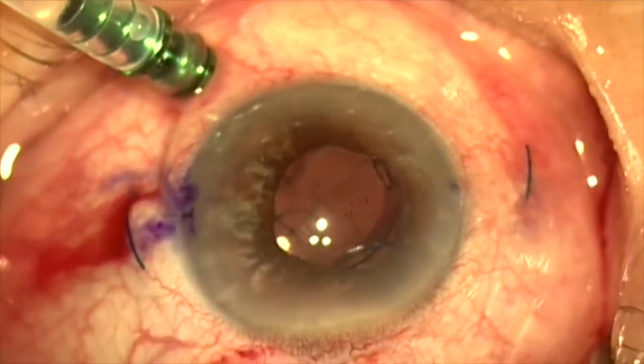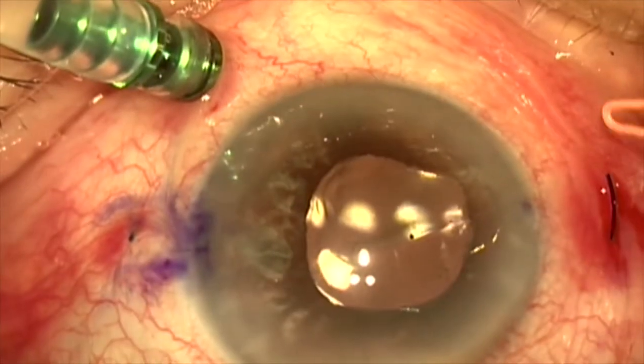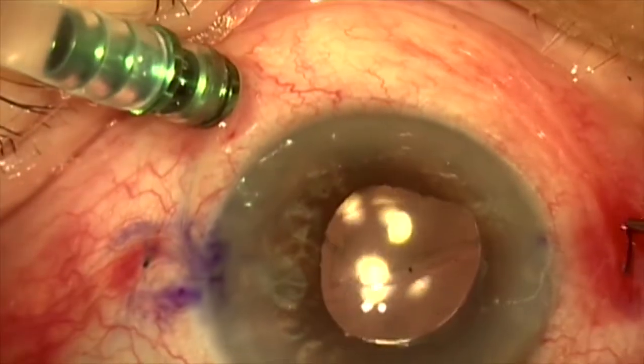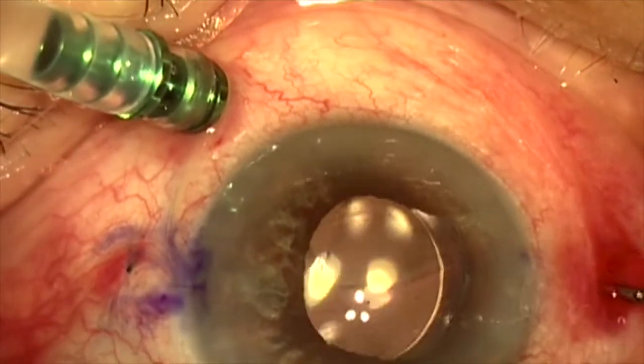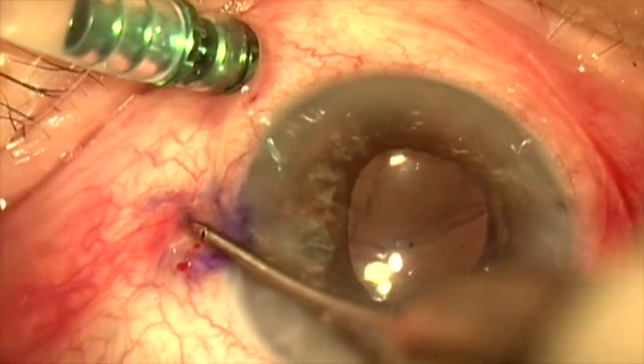We'll now melt the tip of these haptics with a hot-tip cautery. We'll tuck these haptic tips into their respective scleral tunnels, and the lens centers very nicely.